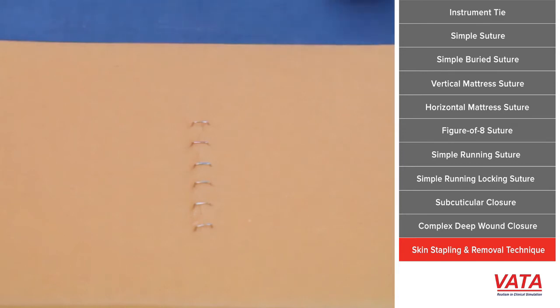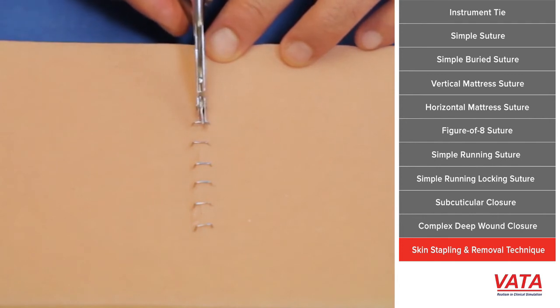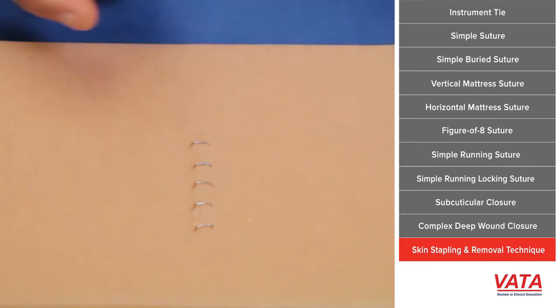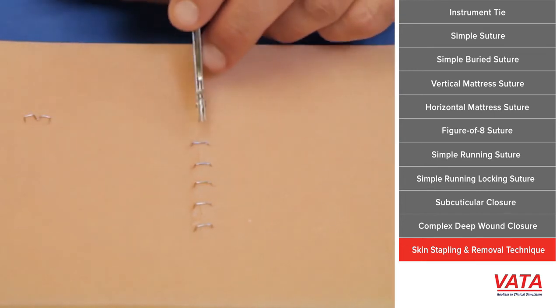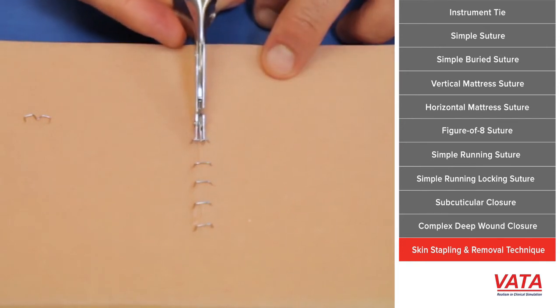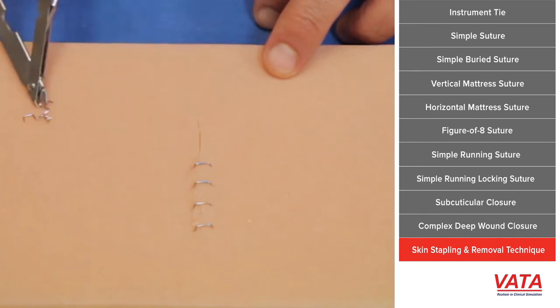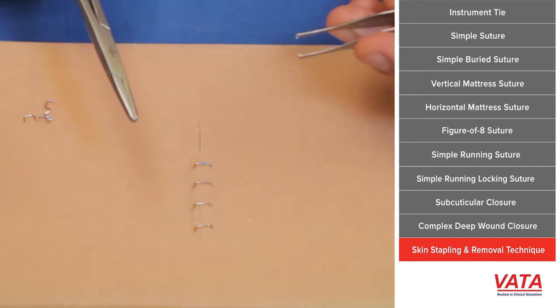So now they become straight, and then the staple will literally simply lift out of the wound, very simply. So we push down, it spreads, and as it straightens, it just pops straight up. If you don't have a staple remover, you can also use a needle driver or a clamp and place it under the staple and just spread, and basically spreading is doing the same thing. It's straightening out. This is much less painful for your patient though if you can use one of these devices, because as I said, it straightens everything out and simply pulls out, and there's no pulling.